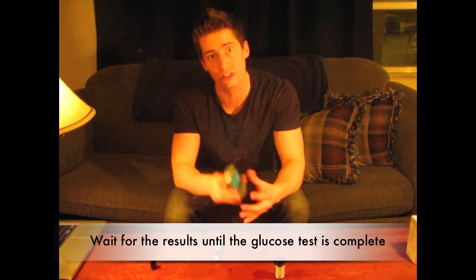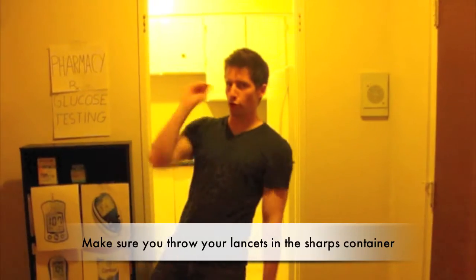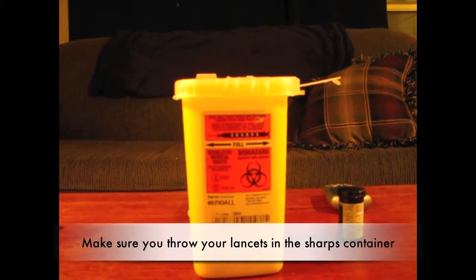Last thing you should learn from this melody would be: wait for the results until the glucose test is complete. Your glucose levels is practically a no-brainer. Make sure you throw your lancet into the sharps container.